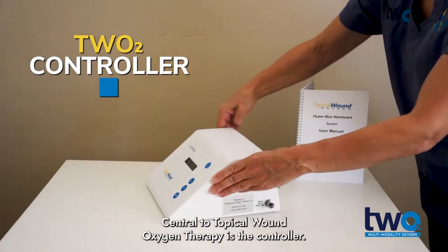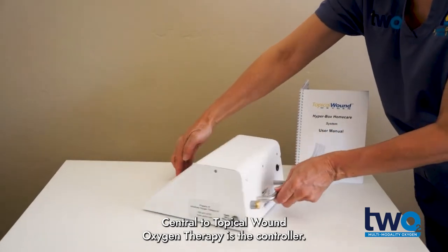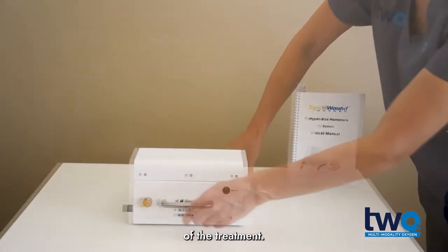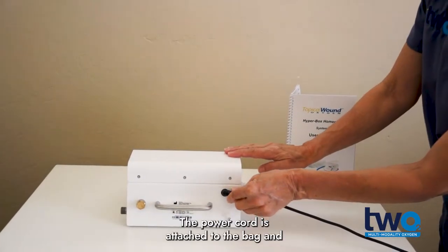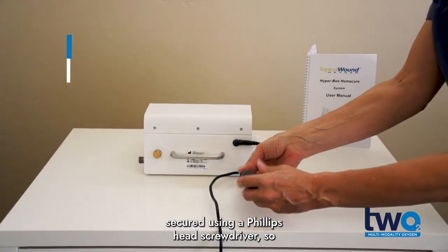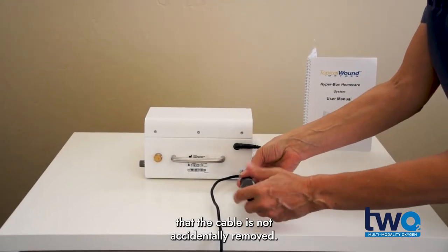Central to topical wound oxygen therapy is the controller. The unit monitors the pressures and controls the therapy for the duration of the treatment. The power cord is attached to the back and secured using a Phillips head screwdriver so that the cable is not accidentally removed.